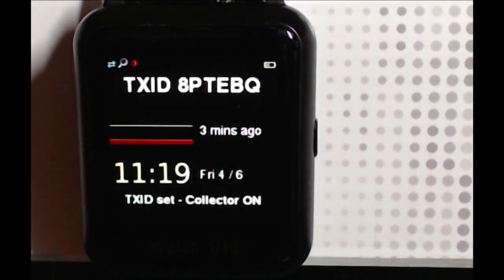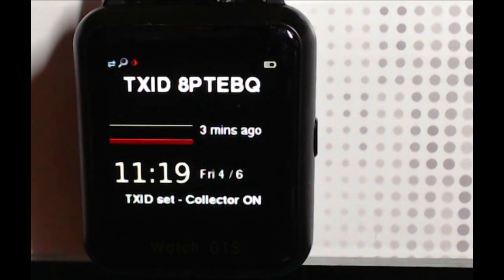Now the transmitter ID has been set, the BlueJay will search for that and if everything's already running on that transmitter, you'll start to get data show up on the main screen.